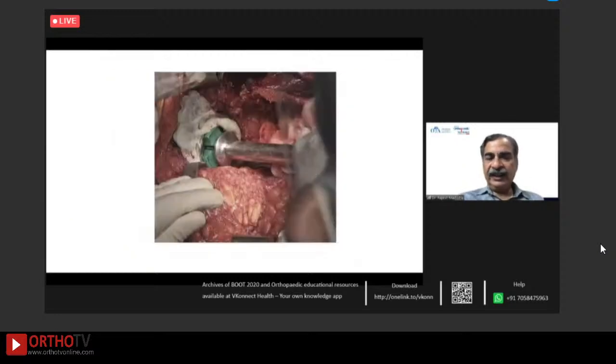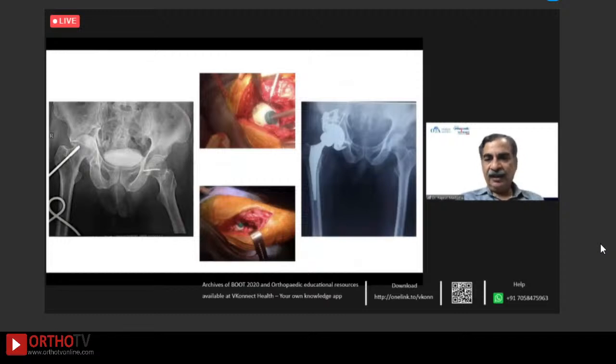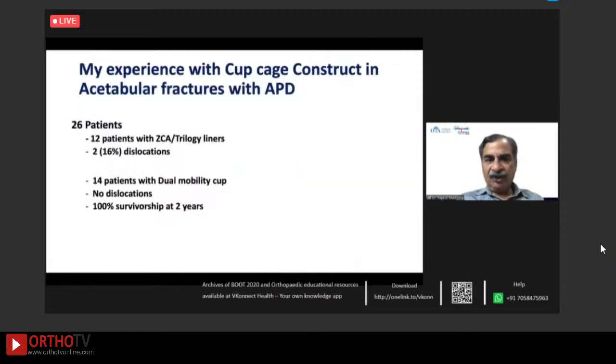So, a quick word about cementing dual mobility in this cup cage construct. And this is an example. And you can see the dual mobility cup was cemented.